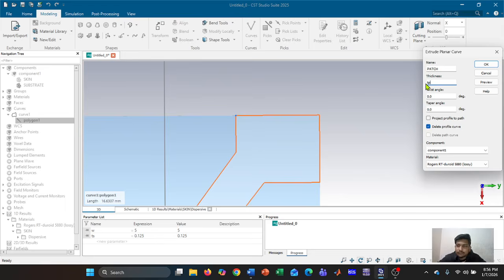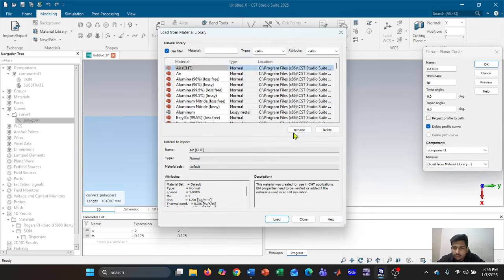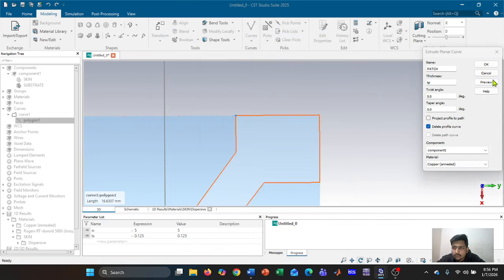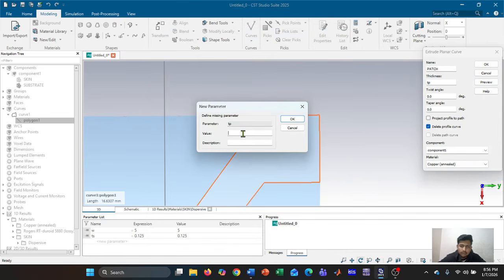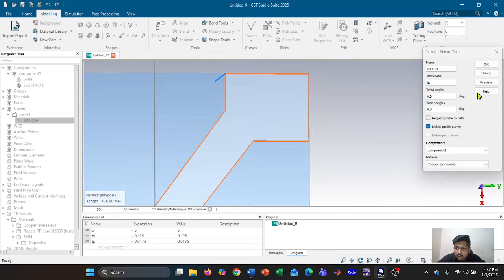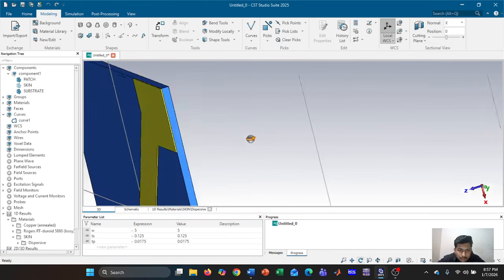This is the patch. The thickness would be TP and the material would be copper. So copper annealed on this one. Okay, load, preview. The thickness of the patch would be 0.0175. Okay, click OK, and this is the patch. Click OK.